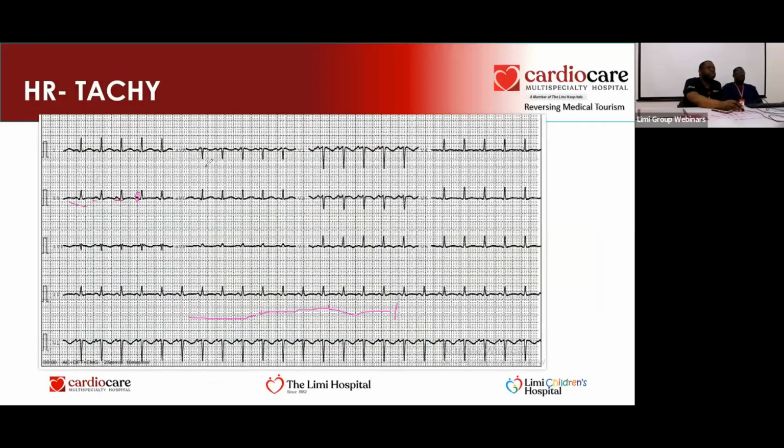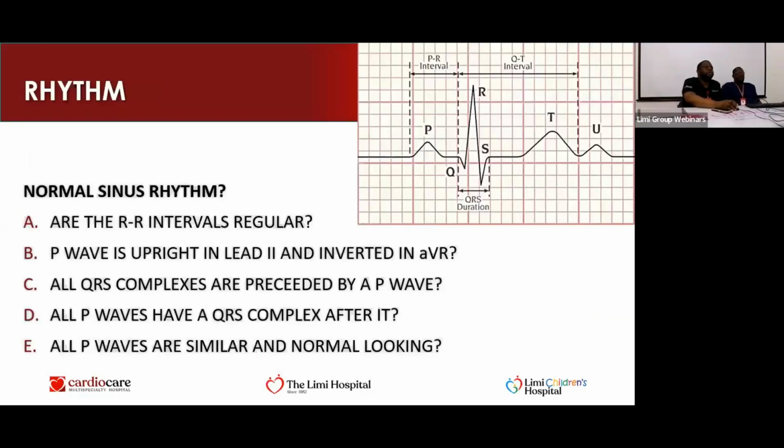Now in AVR, this P wave here is facing down. So that is what we say: is it upright in lead II and inverted in AVR?